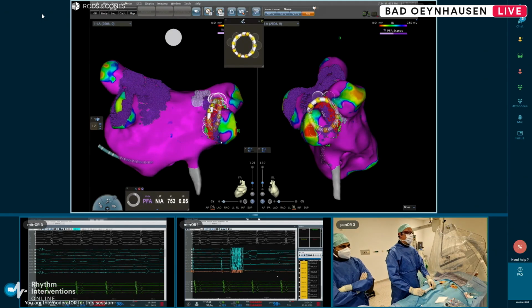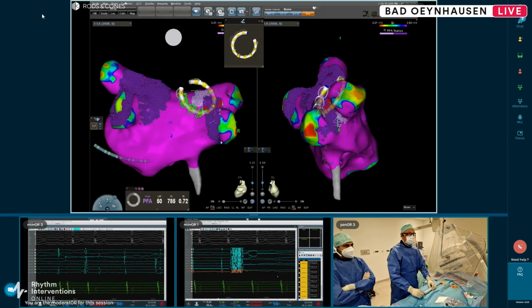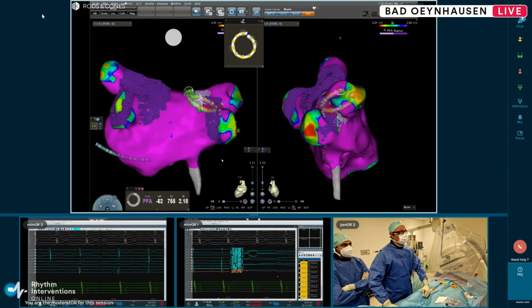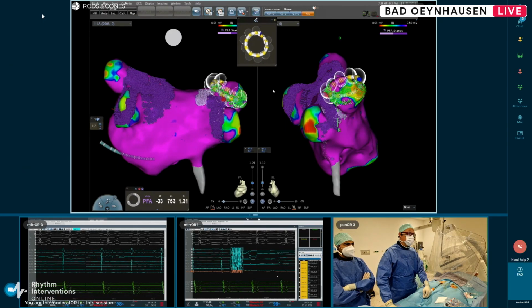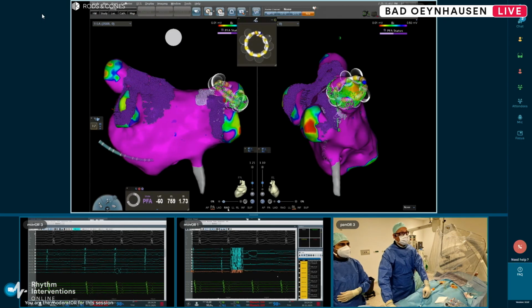So now we have these 4 applications here. We go now to the superior vein, which is then already our last vein. Unfortunately, it makes fun, but he has only 4 veins. We see here again the signal. We try to open the catheter once again. It's always the same. We have good TPI now, looking at the bullseye and all electrodes. So here's the first application, please.